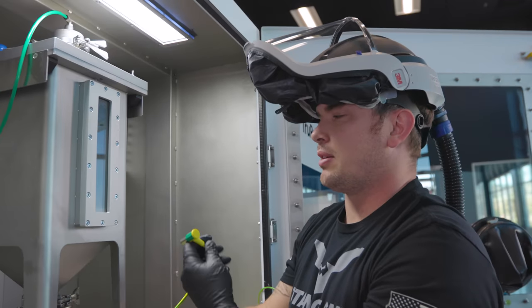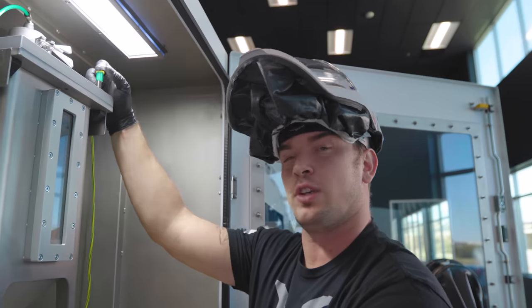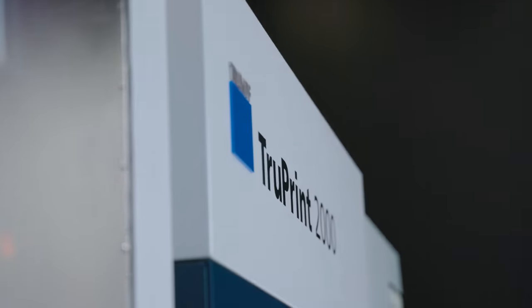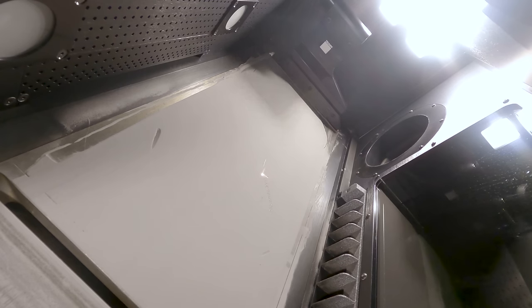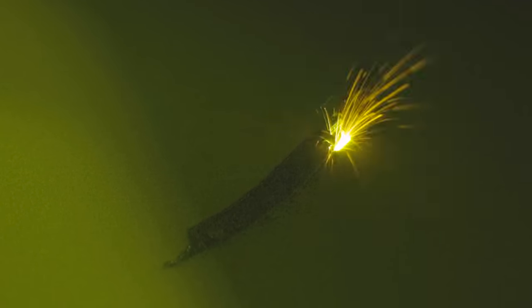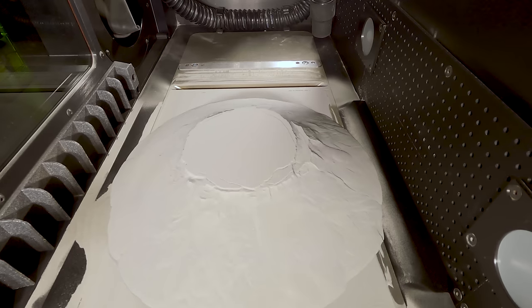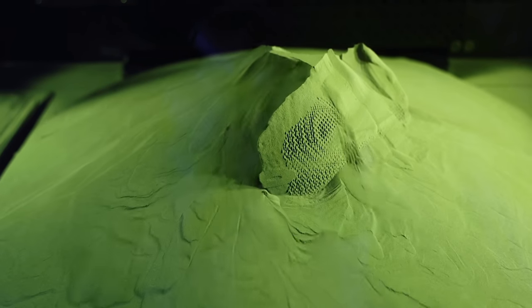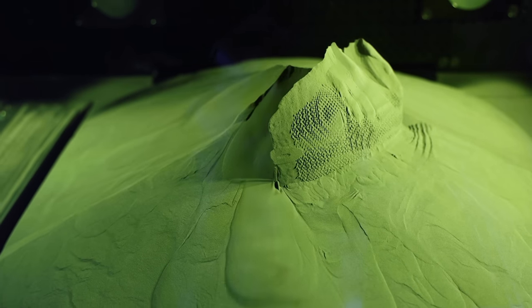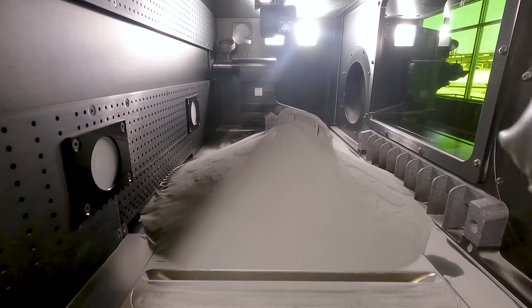Titanium is the most biocompatible metal on earth. You can print with it. It checks all the boxes. After sieving this powder from the overflow bin back down into our supply cylinder, we're ready to print our skull implant and hopefully change somebody's life. We just 3D printed a high-end skull implant that's going to be surgically installed into someone's head and completely change the course of their life.